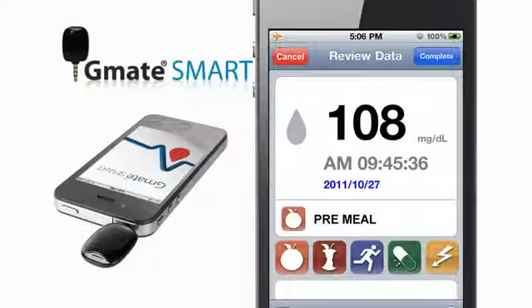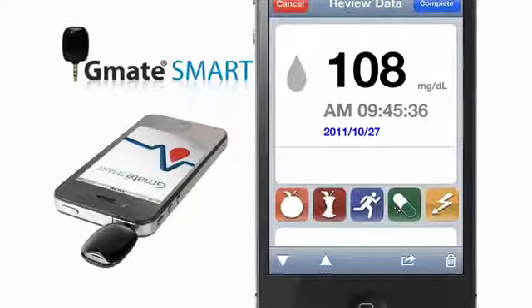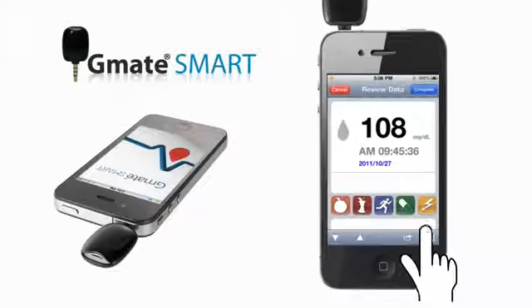such as pre-meal, post-meal, exercise, medication, and stress, or simply type a custom comment. Remove the test strip and touch the Save button to store the test result.